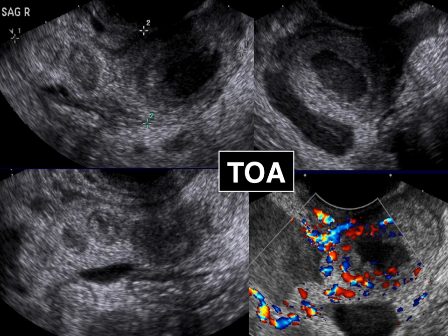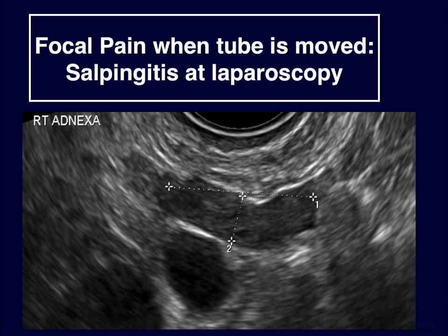Here's a patient that came in, a young patient who had focal pain. And the tenderness-guided ultrasound led me to this rather dilated, swollen tube. And that's where her pain was. And this turned out to be salpingitis.